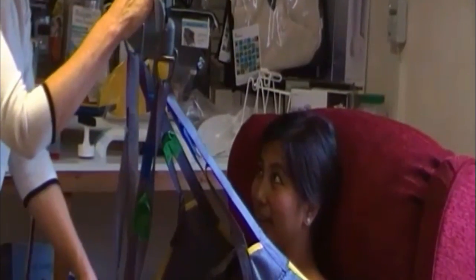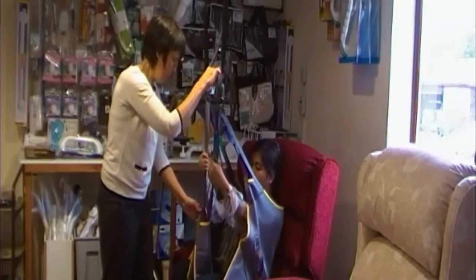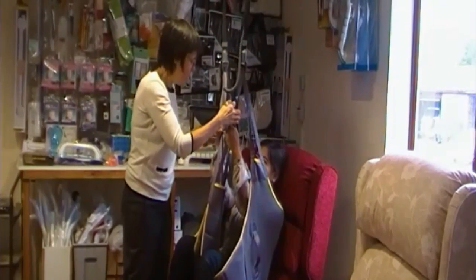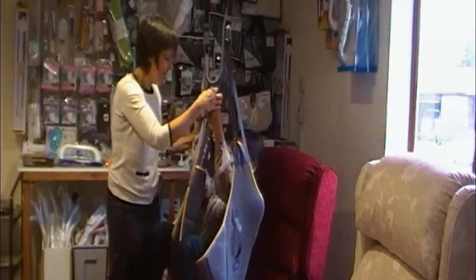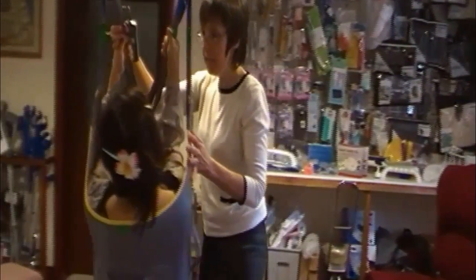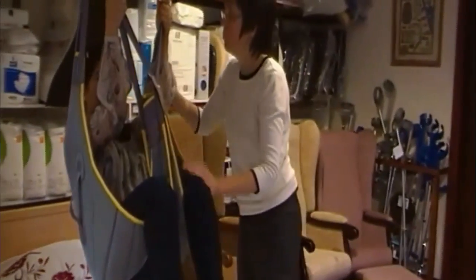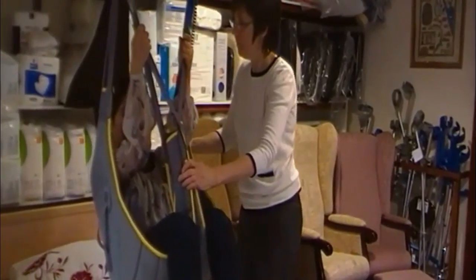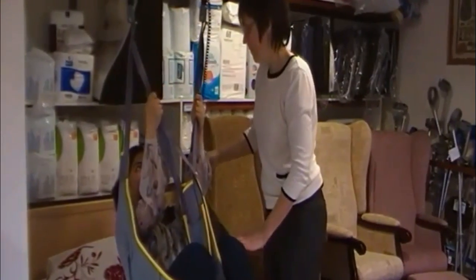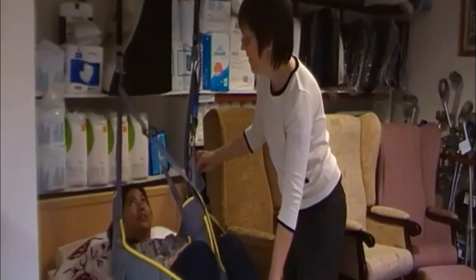Okay. If you want to hold on here. Right, just relax. It's quite safe. That's it. Then you see I can hold on to you and I take you along to the bed. I'll just put you down. Alright, you can let go now. That's it. And put your legs down.